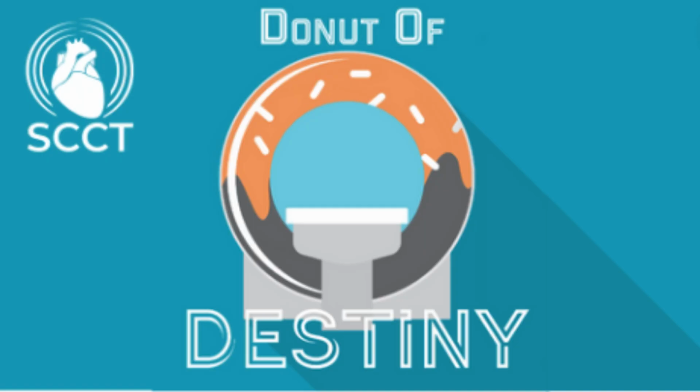That was one of the advantages of it, that we can use our CT data set and put a virtual device in there and then simulate flow around that device. This could be potentially useful in very complex appendage anatomies with multiple lobes or chicken wings. And we can help predict either paradevice leak or which anatomies are at a higher risk of forming device-related thrombus.